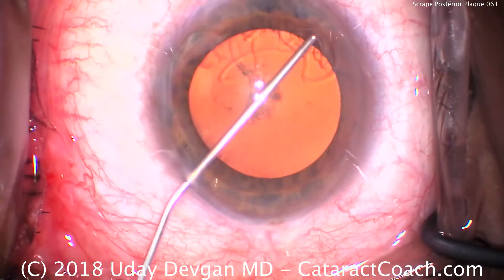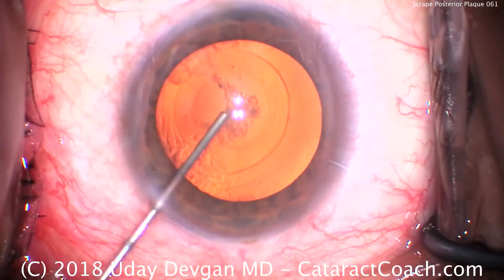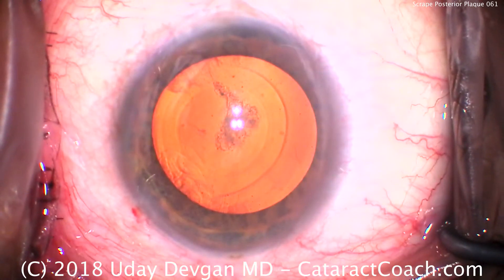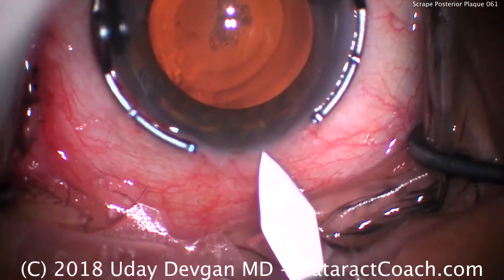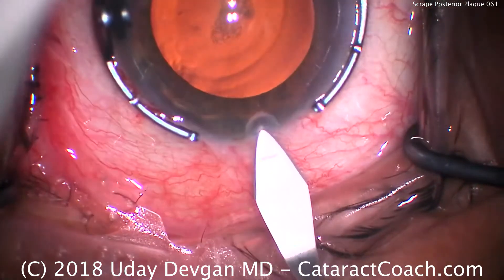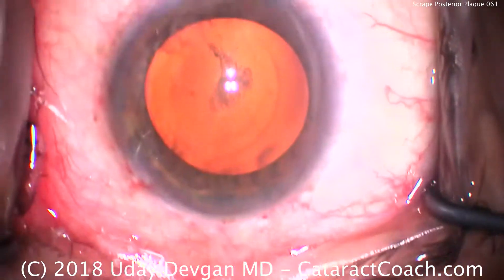We're going to fill our anterior chamber with viscoelastic. There's the wave of dispersed viscoelastic coating the endothelium. Time to hold the eye with our fixation ring. We'll use our keratome to make a temporal incision, starting at the limbal vessels, with appropriate tunnel length.